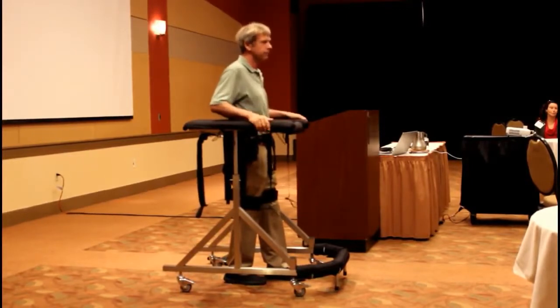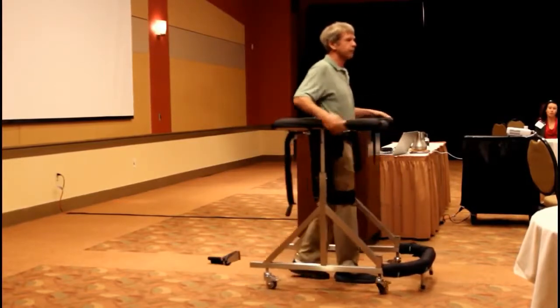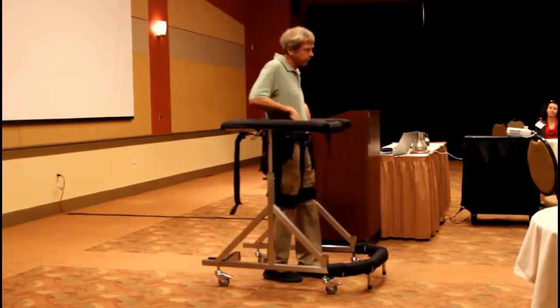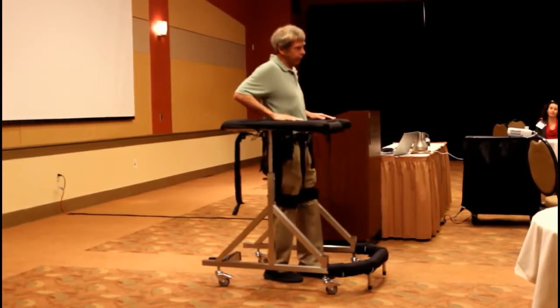Oh, that's great. So you also can adjust that for various levels of weight bearing? Yes. So you can challenge them at the level they need to be challenged. If you wanted to raise it up higher, the moment arm and the center of gravity will change.